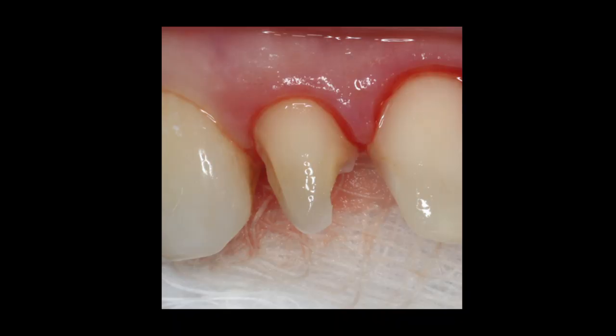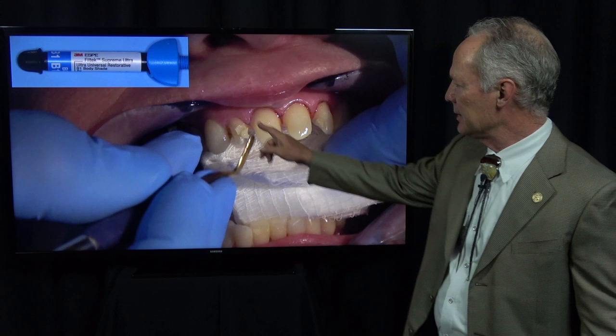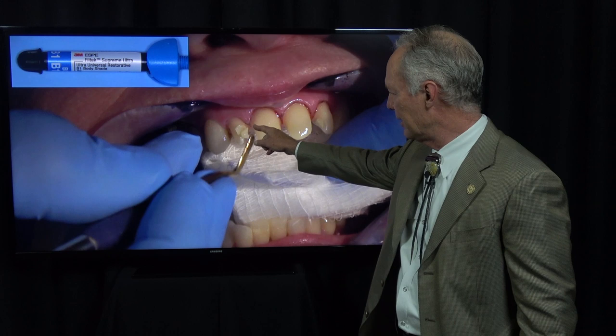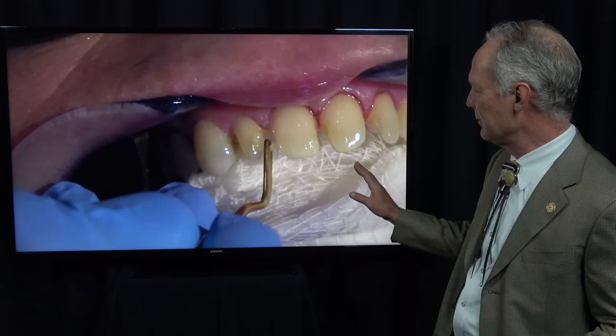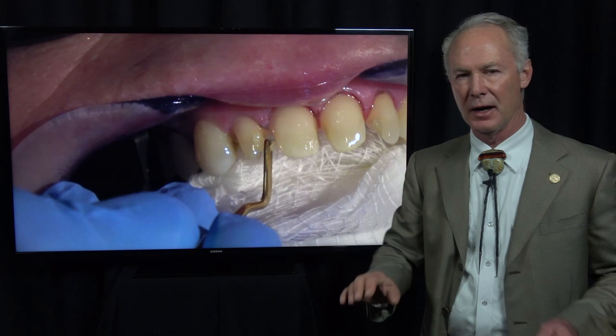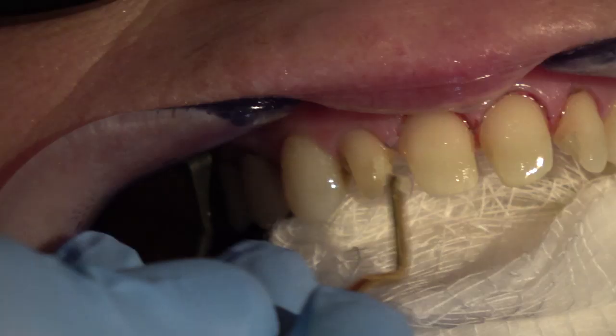Then we've got this broken off part right here. So what I'm doing is placing some Filtek Supreme highly filled resin in that broken part. I'm not curing it, I'm just placing it in there. Now I would do this same thing if there was interproximal decay on the teeth. I would not remove the decay at the time of tooth preparation unless there was a lot of decay. I would remove the decay at the time of seating, and if it was very large, fill it with highly filled resin. If it was small, I would fill it with flowable composite at the time of seating.